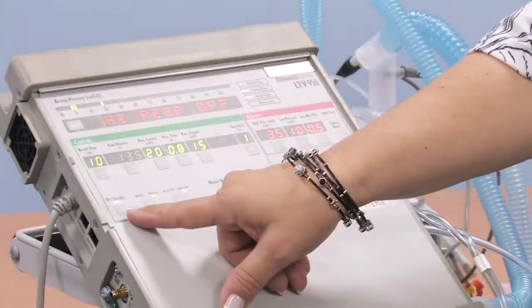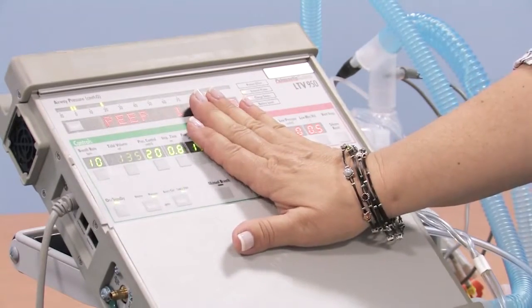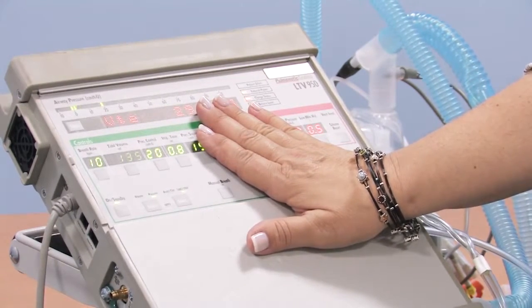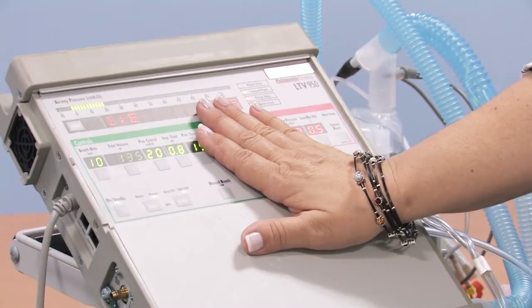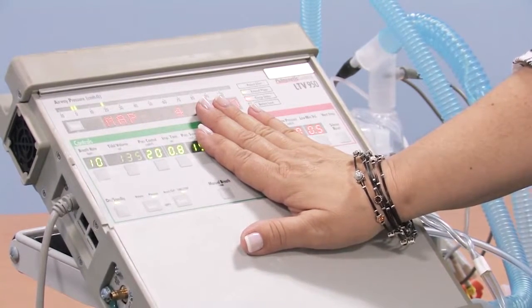We're going to look at the LTV 950 in operation now. What you'll see is that we have a power light as it's on. We are in the pressure control mode, meaning that the mandatory breath rate of 10 is going to fill the lungs up to a pressure of 20, and it's going to inhale for your child 0.8 seconds for each breath. So 10 breaths a minute, pressure up to 20 to fill the lungs, which was predetermined, and inhale time 0.8 seconds, also predetermined by your child's physicians.